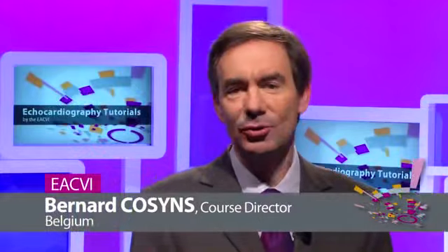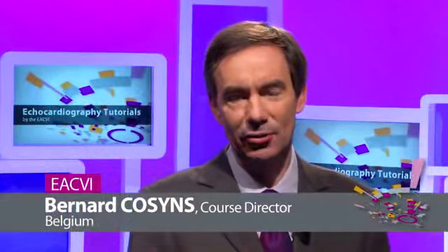So Dr. Mouraru will now show how to assess secondary tricuspid regurgitation. This is a kind of tricuspid regurgitation where we cannot find any abnormalities at the level of the leaflets. This is by far the most frequent cause of tricuspid regurgitation. She will now move to the way to assess the severity of this disease and also to look at the consequences of the tricuspid regurgitation on the right ventricular cavities and annulus.